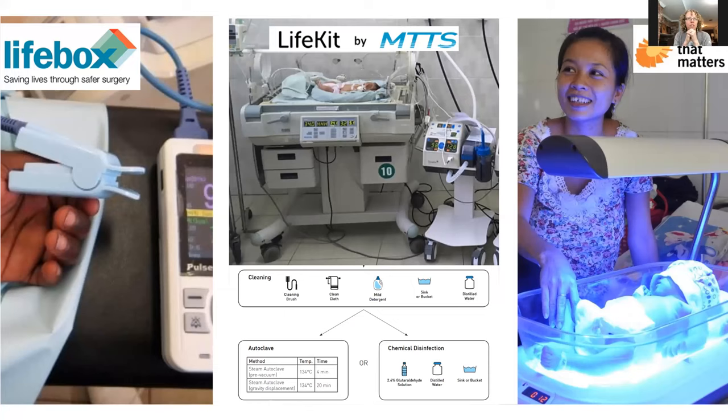One of the wonderful projects that they have done in the past is around a pulse oximeter. And the way these are currently used before the Lifebox pulse oximeter came to market is that usually these probes that you have to wrap around someone's finger are made of some kind of a sticky bandage material. And as that works in a low middle income setting, because each probe tends to be $30 to $40 and you're supposed to use only one per patient, most people try and reuse it. So we visited many hospitals with Design That Matters and also Spark Health Design where people are sort of trying to wipe down the sticky bandaid and then reapply this probe. So Lifebox came up with a wonderful solution as a nonprofit focused on LMICs that has this reusable probe for pulse oximetry.